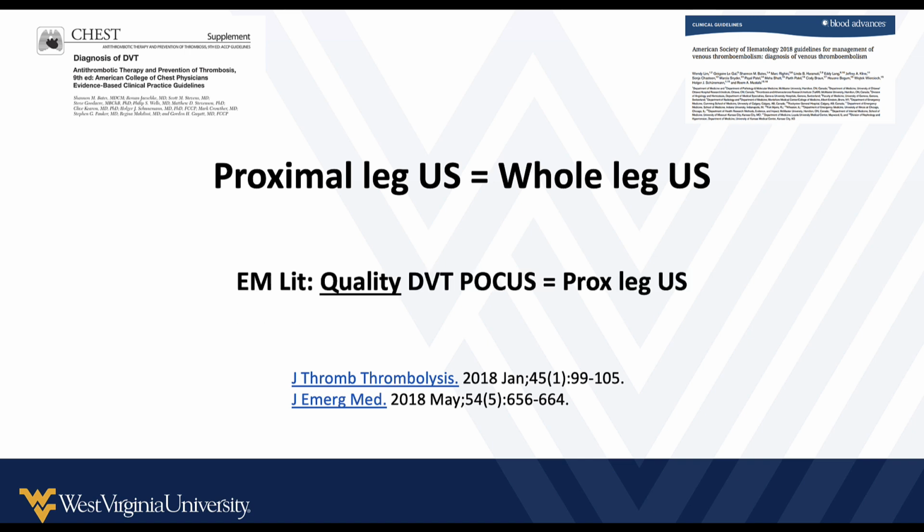And from the emergency medicine literature, where most of the literature for point-of-care ultrasound has been done, it's been shown that a quality DVT point-of-care ultrasound is equivalent to a proximal leg ultrasound in a vascular lab. And we're going to talk about what a quality DVT point-of-care ultrasound consists of.